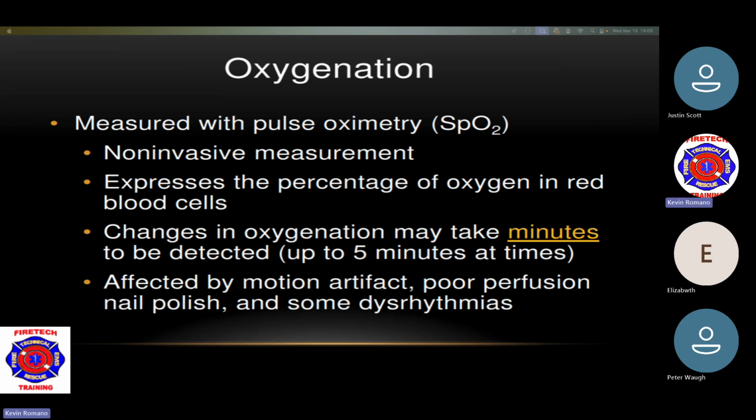It's a non-invasive measurement, so it does not hurt the patient. It expresses the percentage of oxygen in red blood cells. Changes in oxygenation may take minutes to be detected, up to 5 minutes at a time before you start seeing these changes. This is affected by motion artifact, poor perfusion, nail polish, and some dysrhythmias of the heart.